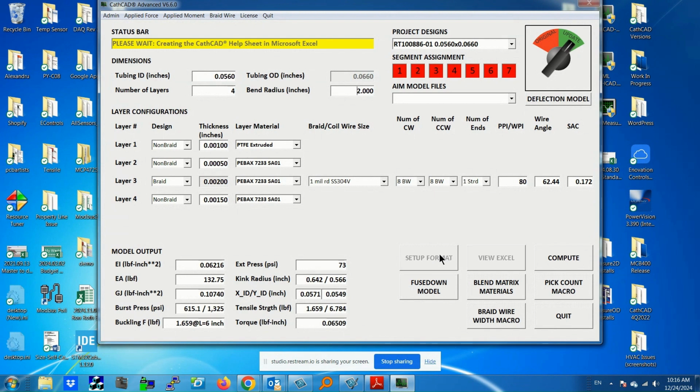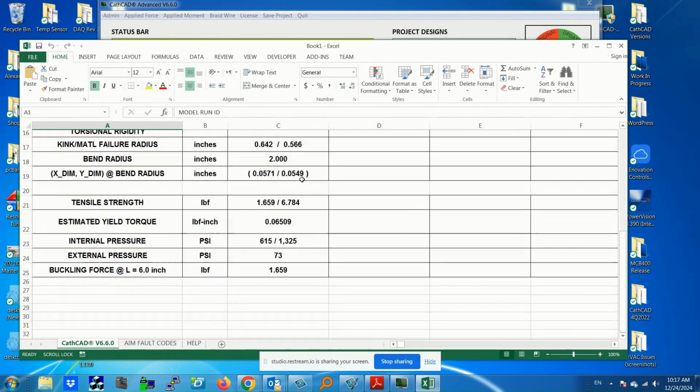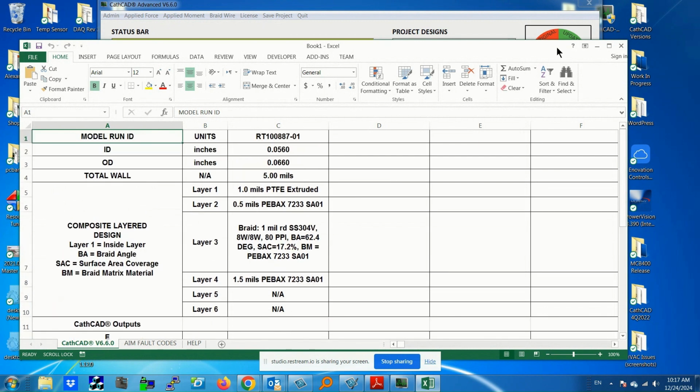And once that's done, I think we're good to go. There you go. Modeling successfully. So this is actually hidden right now. But again, there's my Excel, and all the parameters that were computed are basically exported to the software automatically. So you don't have to do that.